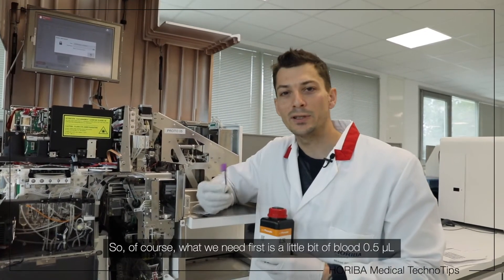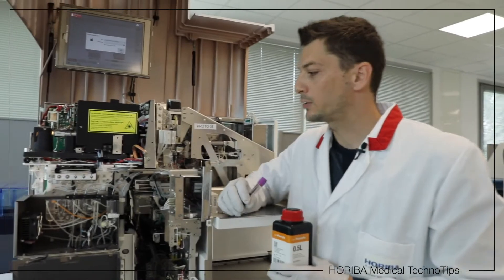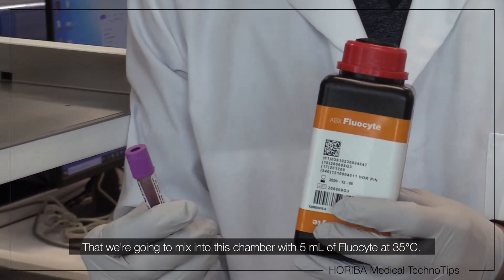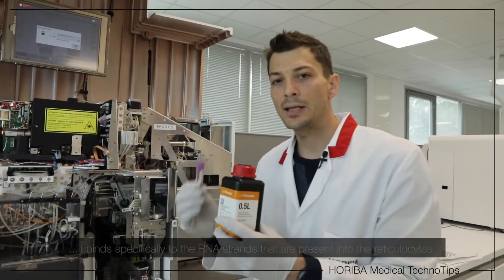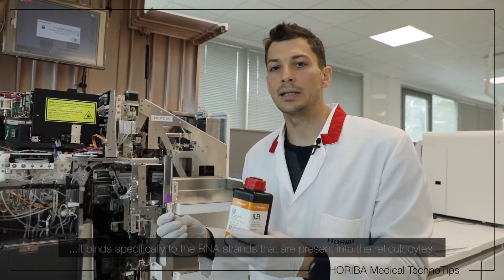So of course what you need first is a little bit of blood — 0.5 microliter — that we are going to mix into this chamber with 5 ml of Fluocyte at 35 Celsius degrees. Fluocyte is a specific fluorochrome in the sense that it binds specifically to the RNA strands that are present in the reticulocytes.